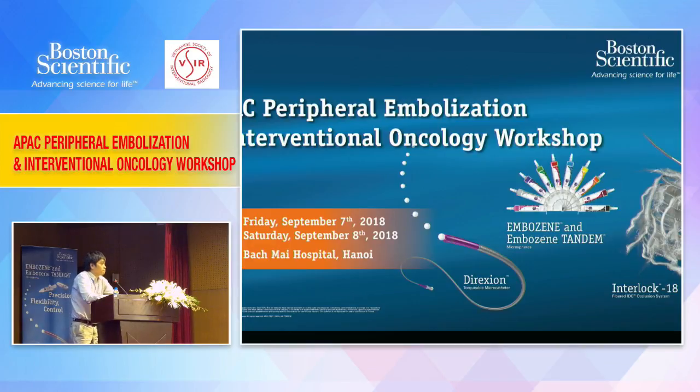Yeah, that's it. I think renal AVM is one thing which is very, very challenging to do technically. Number one, your kidney is floating in the sky. Number two, the feeders usually are very, very tiny and very difficult to cannulate. Invariably, you're lucky if you finish in 1 hour, you're unlucky if it's 4 hours on the table.